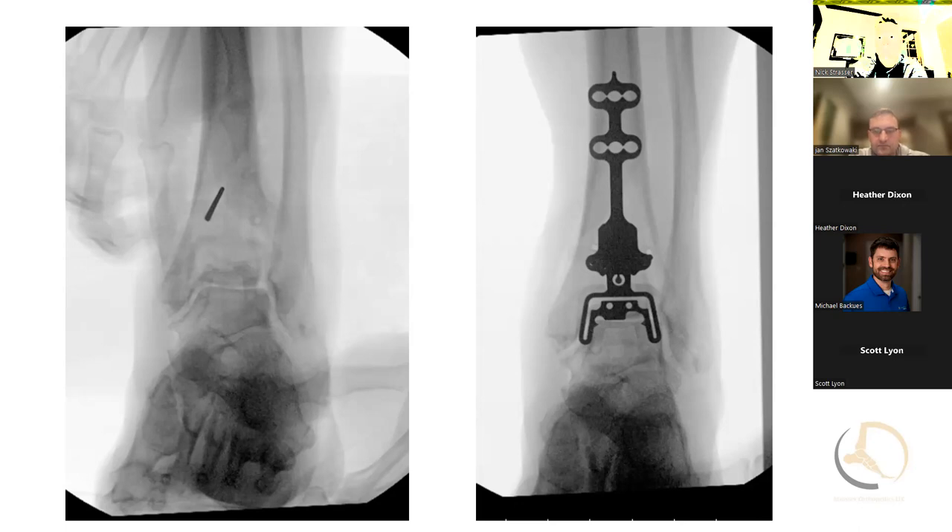I do the same thing — put one wire in first. It's very helpful when the rep reminds me not to skip a step. You put one wire in, check it, make sure the guide fits right, then put a second wire in. I always tell my rep: see something, say something — like the TSA does. Just go slow and let the surgeon check everything. Now going to the lateral — you compare it to your preoperative guide as well to make sure nothing looks funny.